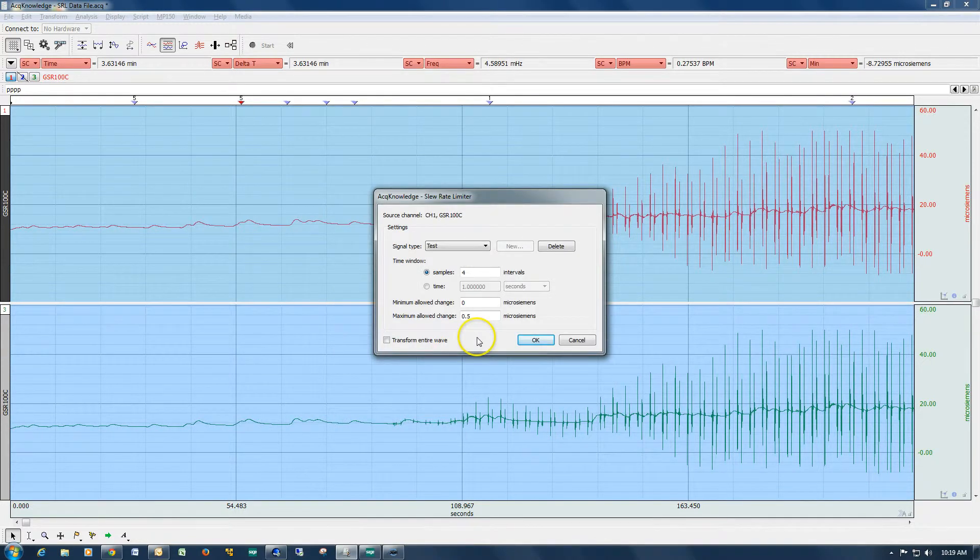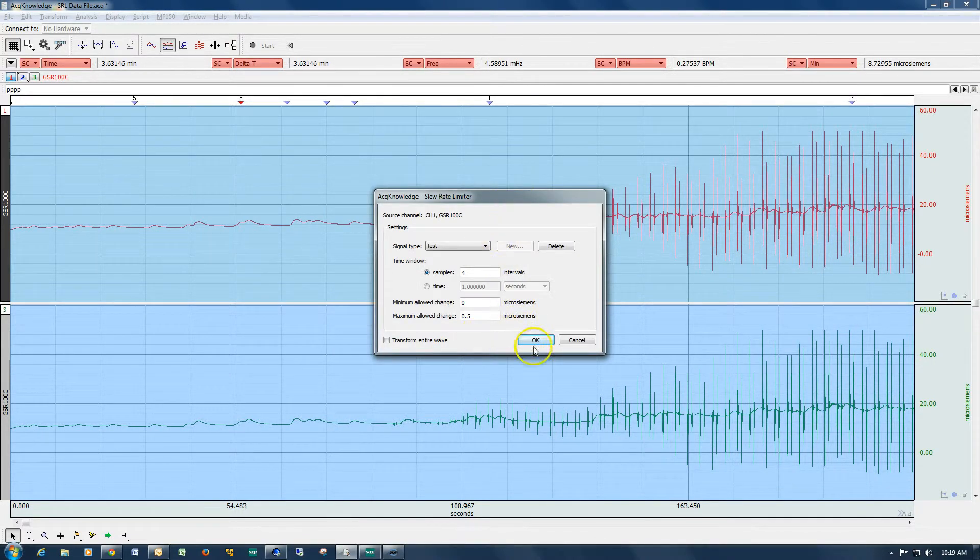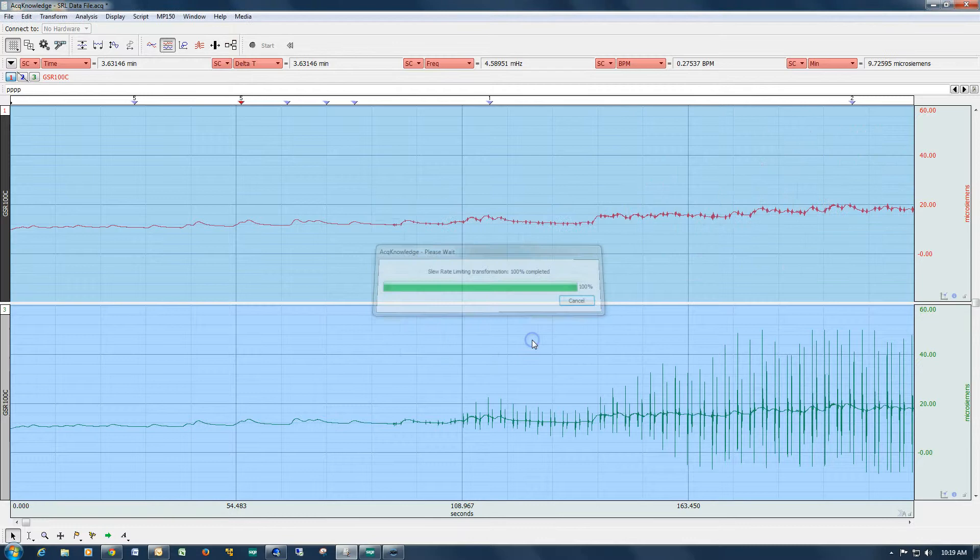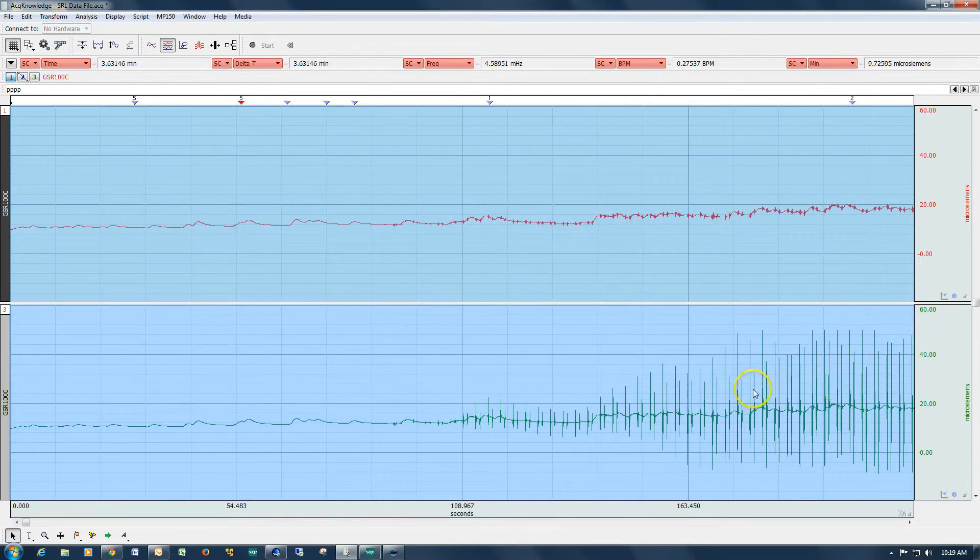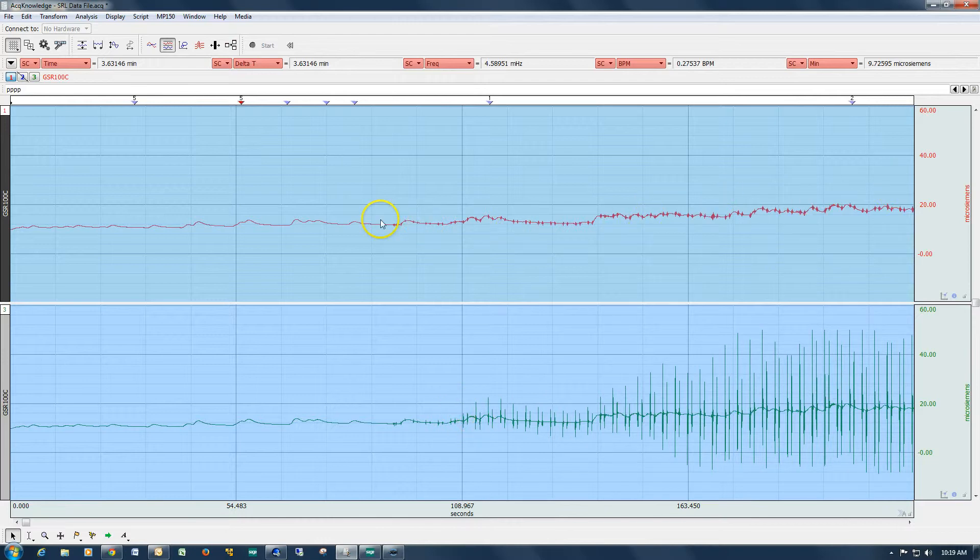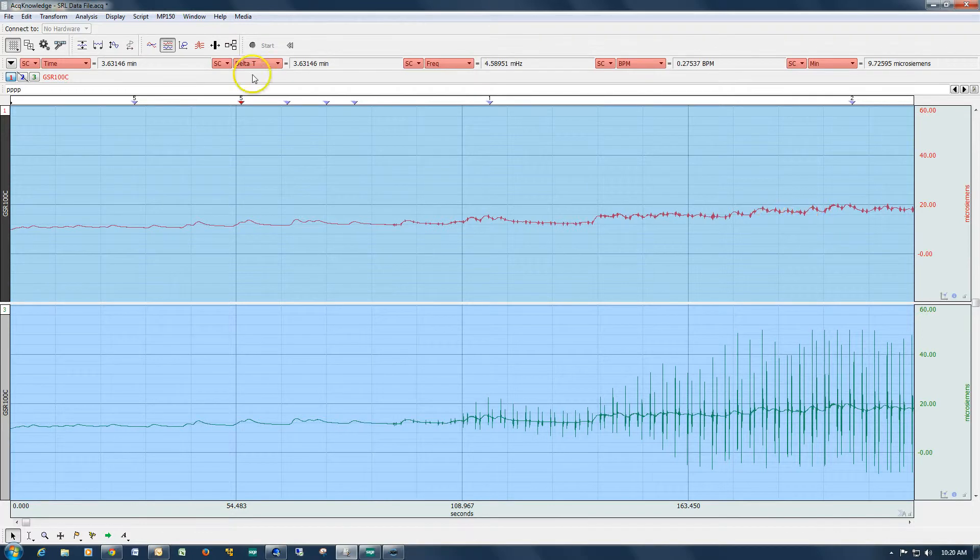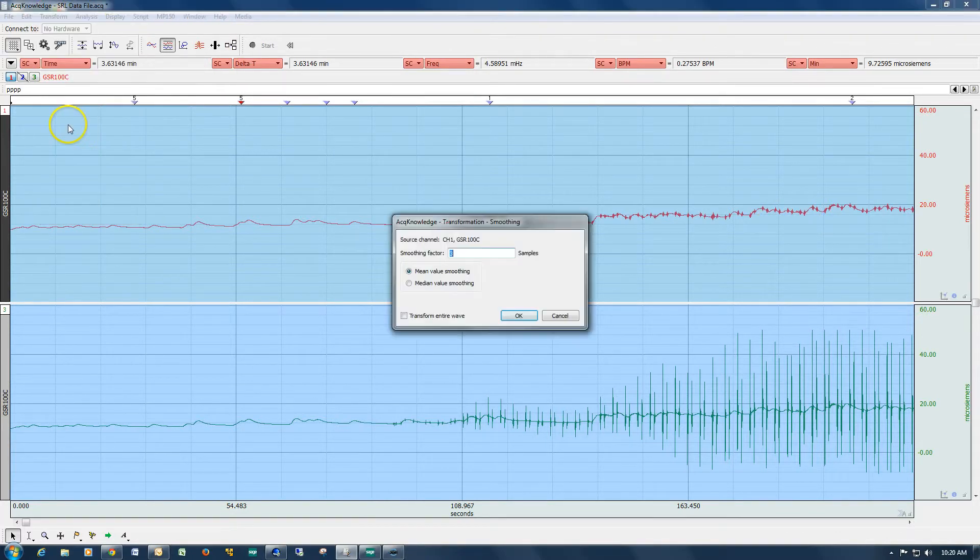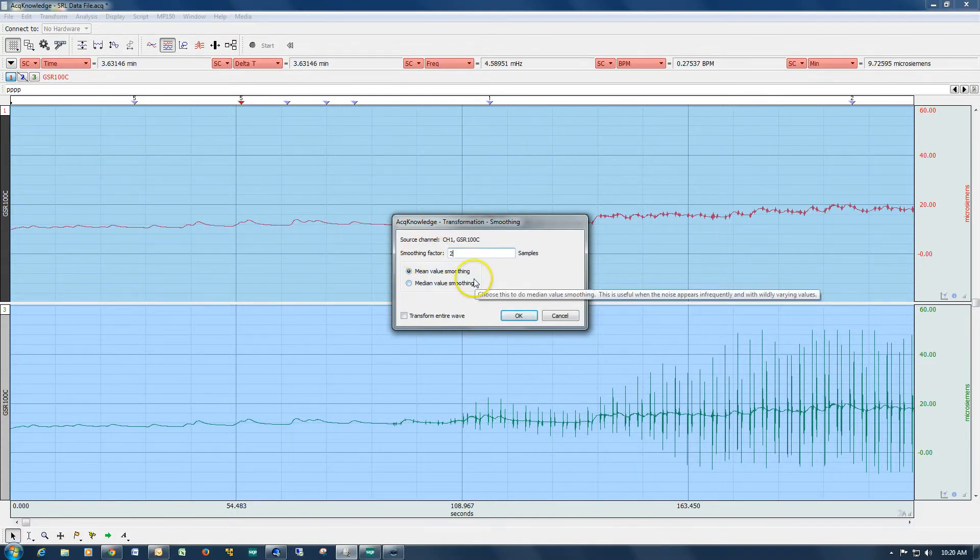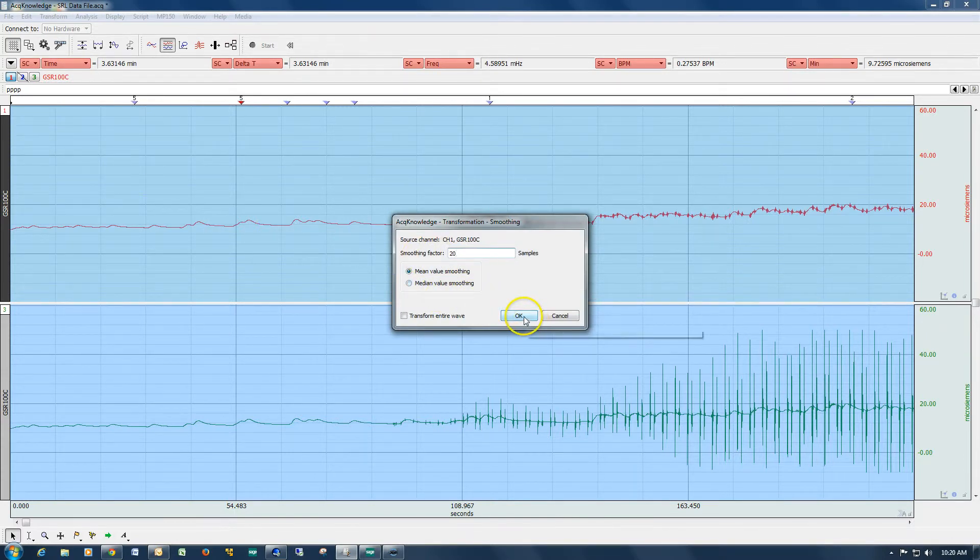OK, so now if we hit OK, we can see that we've almost entirely eliminated the spikes that we're seeing on the green channel. And we can further improve this by using another one of the tools in the transform menu. And this time I'm going to use smoothing. And I'm going to increase the number of samples and hit OK.